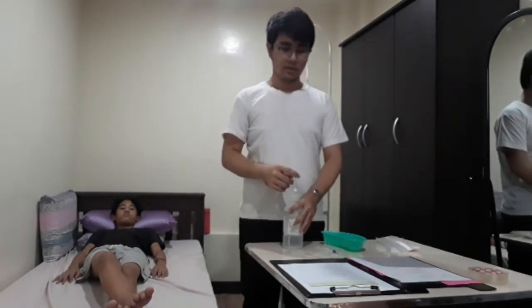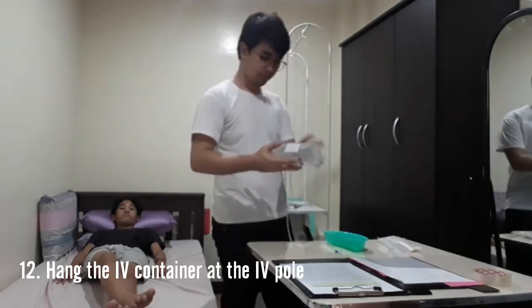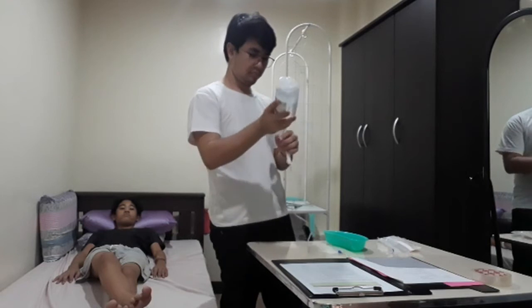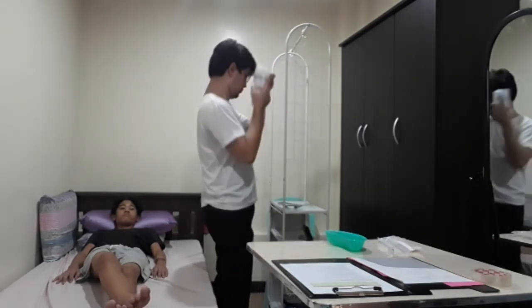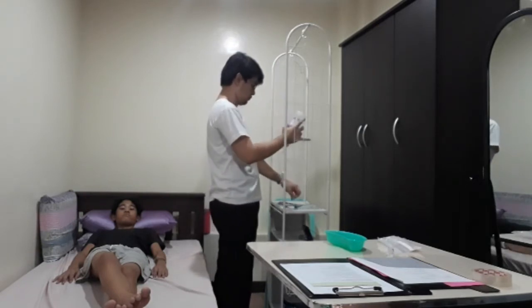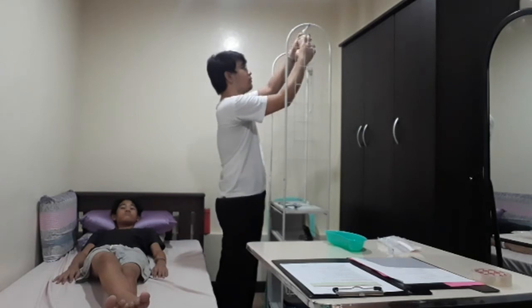Okay. So now we're gonna hang the IV container on the IV pole.